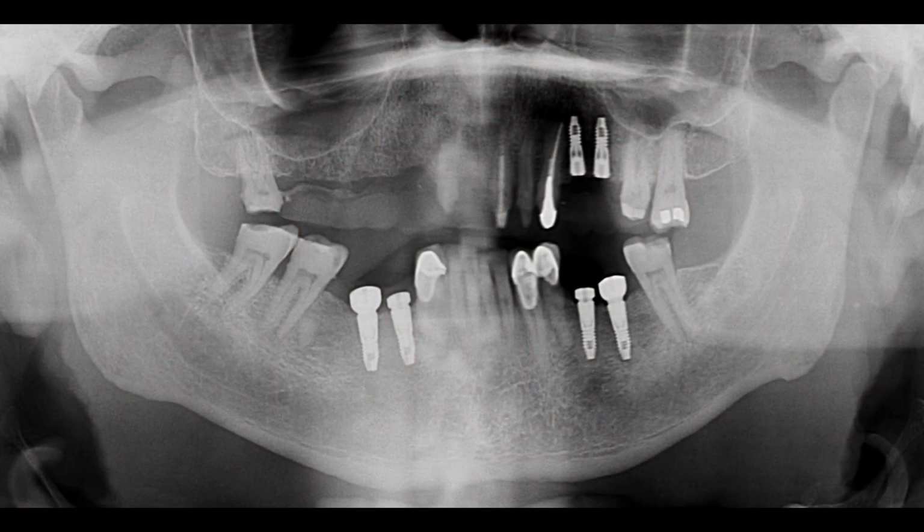So when he finally does come back for treatment, he needs some bone in the right sinus before I can do any implants there. But in cases where the patients have 4 or 5 or 6 millimeters of bone, we can sometimes place the implant and do the bone graft at the same time, which is what we did for him.